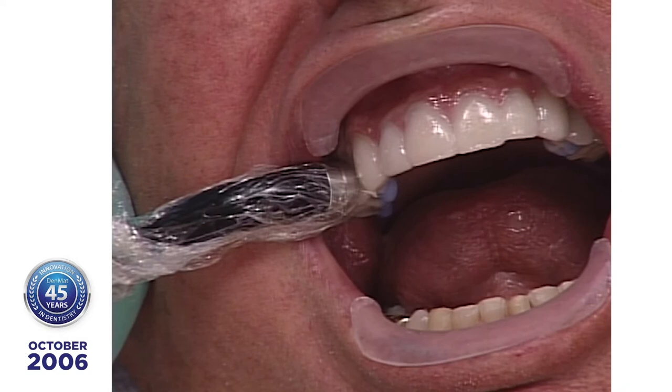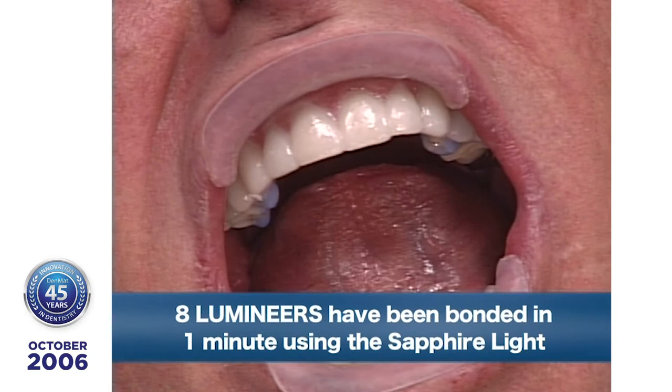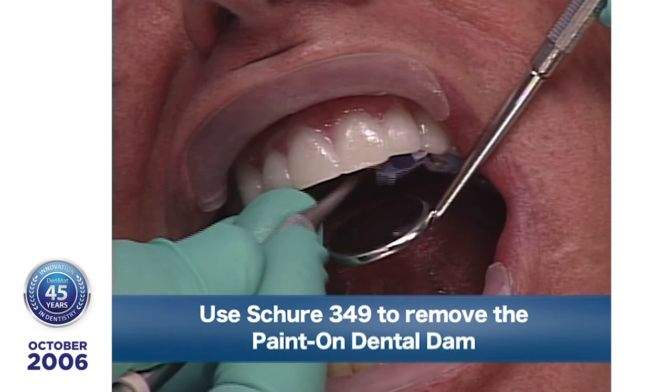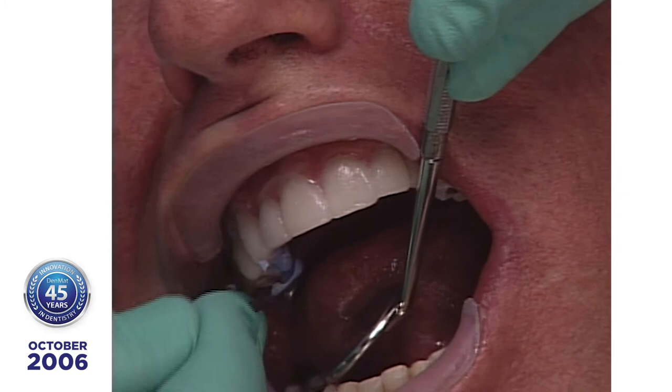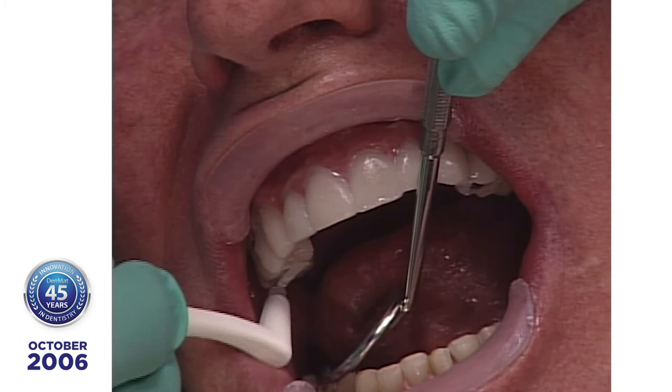Now, in 1 minute, I have polymerized 8 Lumineers. And now wherever we have the paint on dental dam, we'll start removing that, and that will start our cleanup procedure. I'll give you a chance to look at this and you'll see what a big payoff on finishing here with this. There it goes. There's some excess up here. We'll just get that off.